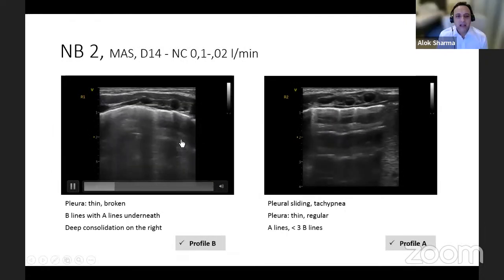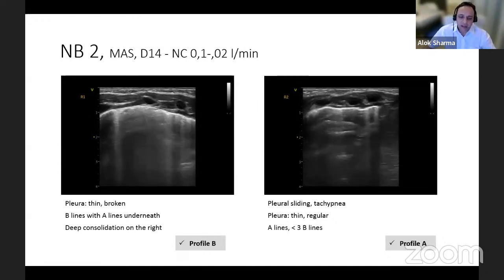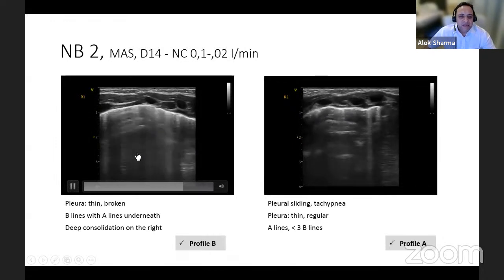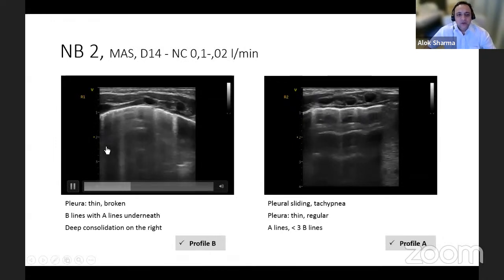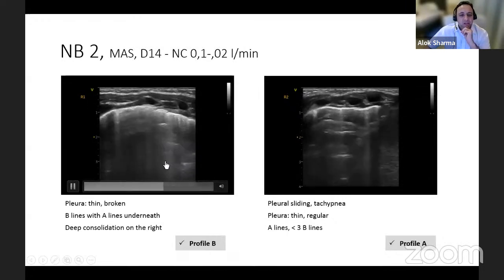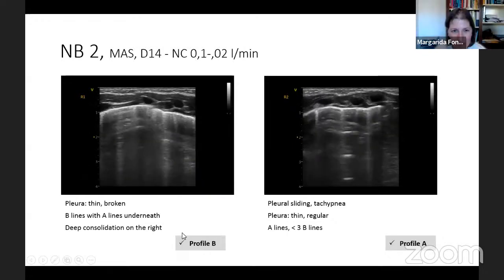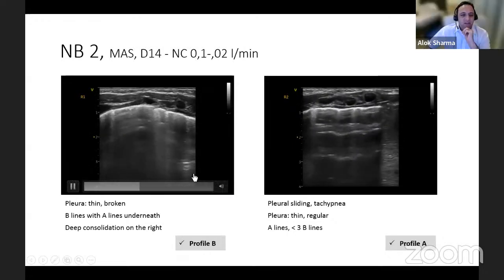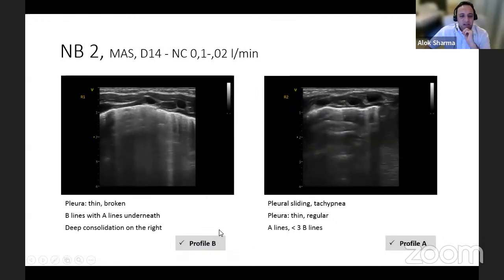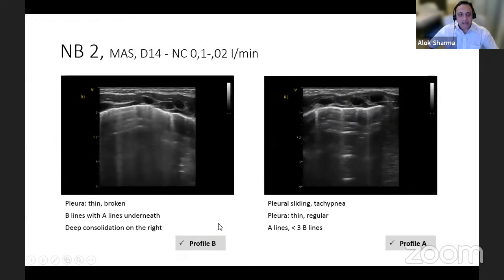Okay, excellent. And once we've interrogated the pleura, just further down, I'd completely agree. You definitely have a dominance of B lines, definitely a few B lines that possibly coalesce into a compact B line, especially on the right side of your screen. And the question, again, from our perspective, is whether you have a deeper consolidation on the right bottom side. Very good depth, up to 4 centimeters. Nice visualization.